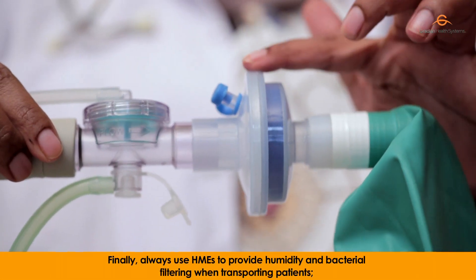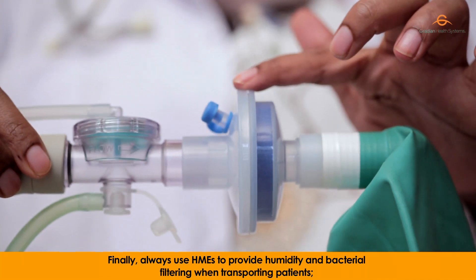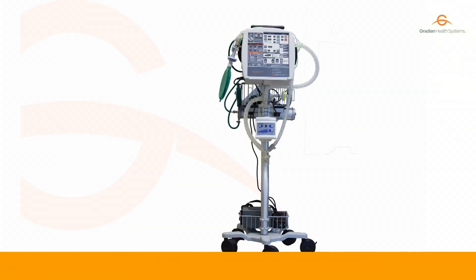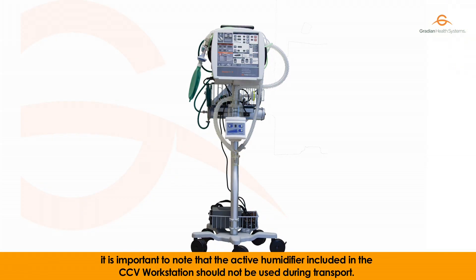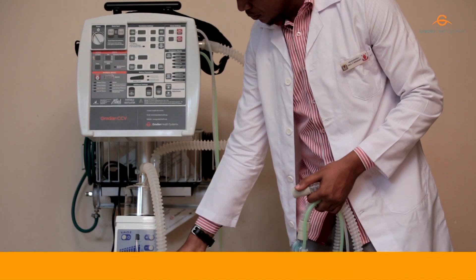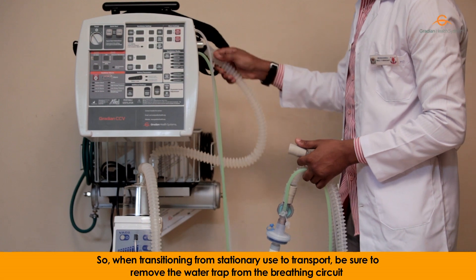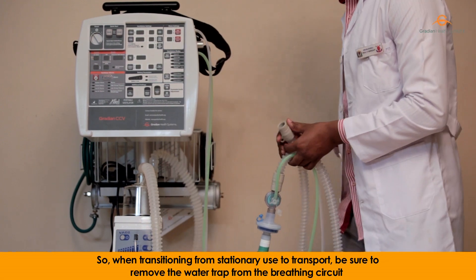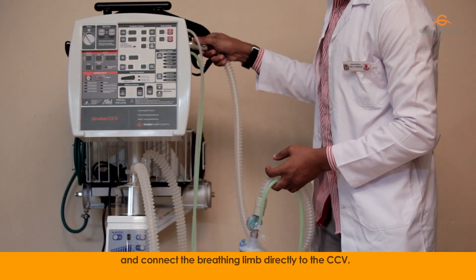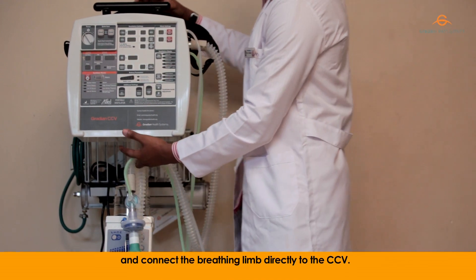Always use HMEs to provide humidity and bacterial filtering when transporting patients. It is important to note that the active humidifier included in the CCV workstation should not be used during transport. So, when transitioning from stationary use to transport, be sure to remove the water trap from the breathing circuit and connect the breathing limb directly to the CCV.